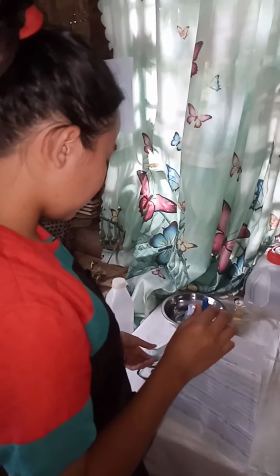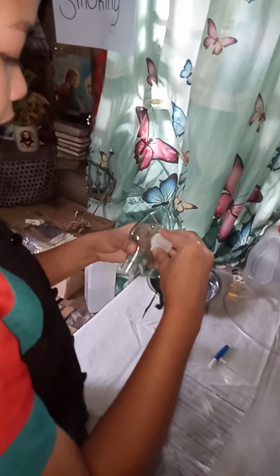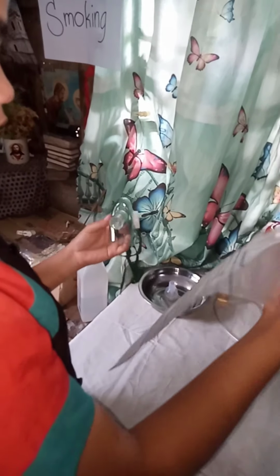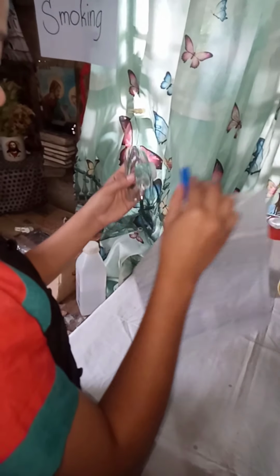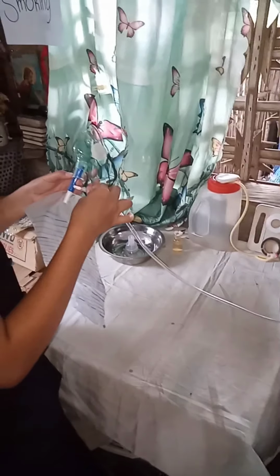Then after that, we also need to put this valve here on the side only. Then attach this non-rebreather bag to the face mask. Then attach this oxygen tubing on this side.